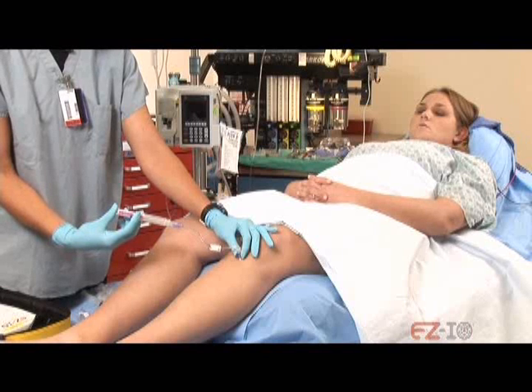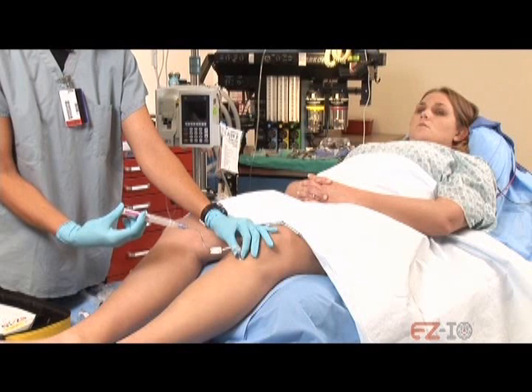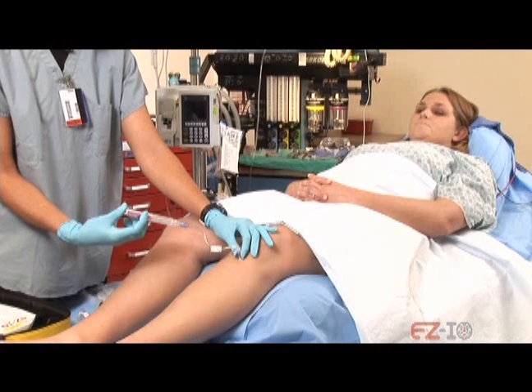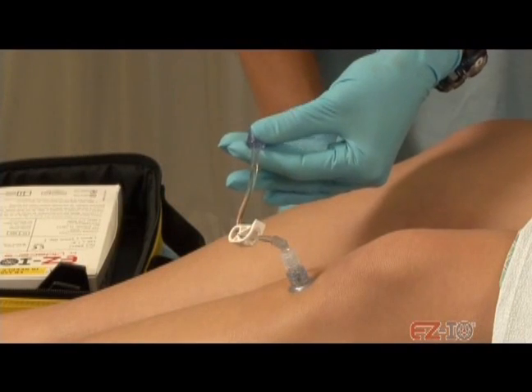Okay. And now? 3. Mm-hmm. Still doing okay? Mm-hmm. What's your pain level now? It's going down. 2. Okay.